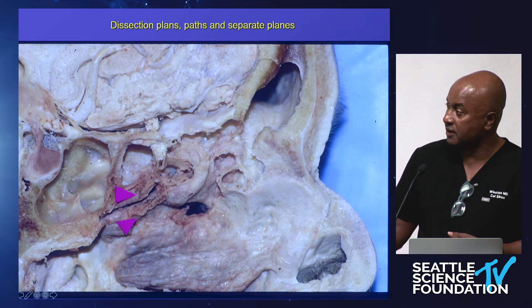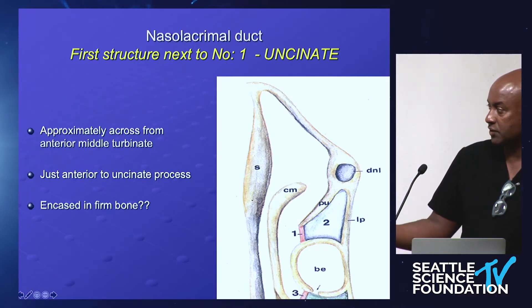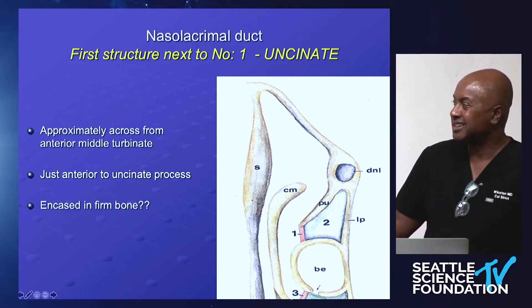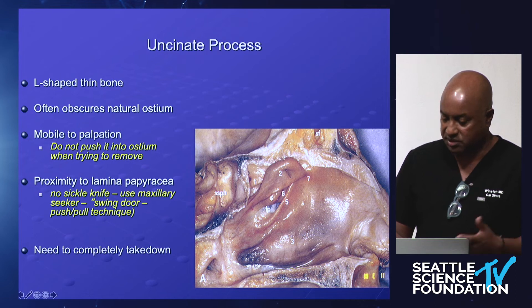Where you really want to be going is angled superiorly. Once you enter the basal lamella of the middle turbinate, convert from a zero-degree scope to a 30-degree scope. I actually don't use a zero-degree scope anymore — I use the 30-degree for the retrobulla recess, rotate it to look at the natural ostium, turn it upside down toward the frontal recess and skull base, then fly over the basal lamella down toward the sphenoid sinus. With a zero-degree scope you're trying to go up and over, but not getting there efficiently. Evert the uncinate process and you can see the natural ostium quite easily.